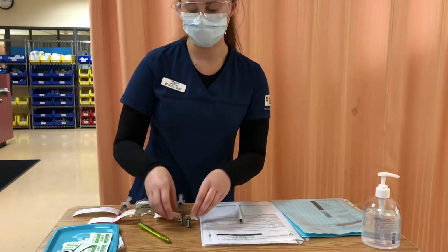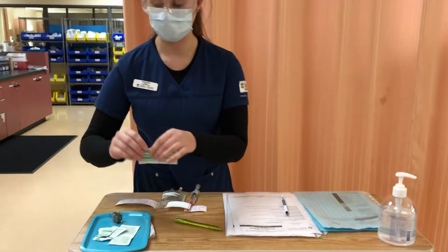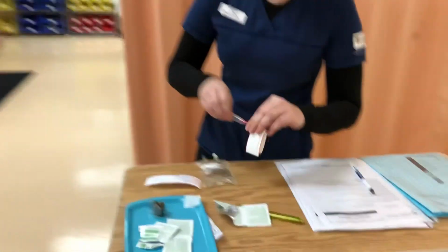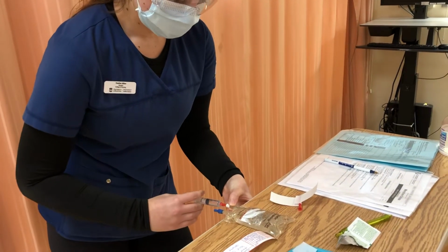The nurse says it's good, so I'm going to put these in the medication waste. I'm going to discard of the normal saline. This is going to go into the sharps, and this is going to go into the garbage. And I'm going to add the medication into the mini bag. So I'm going to clean for 30 seconds and dry for 15. That is dry, so I'm going to insert the medication.